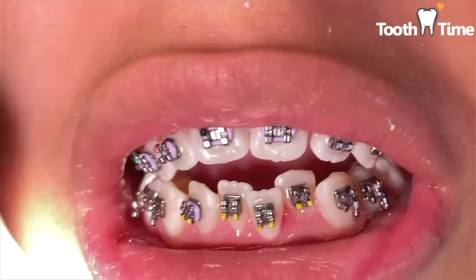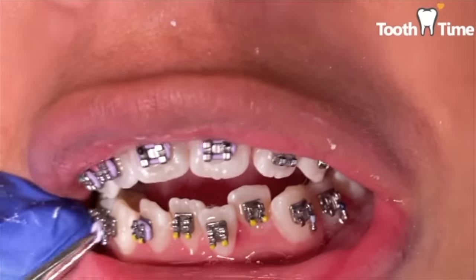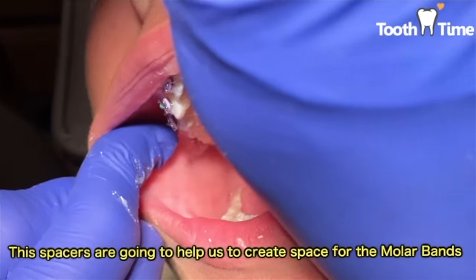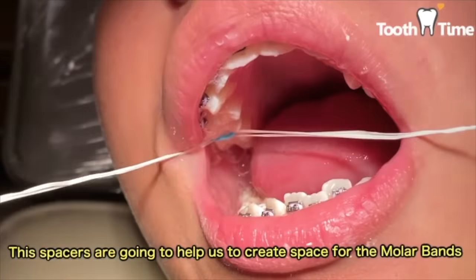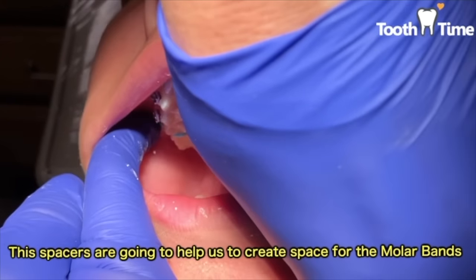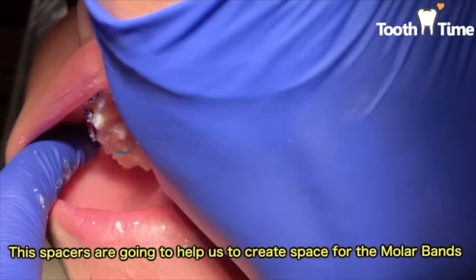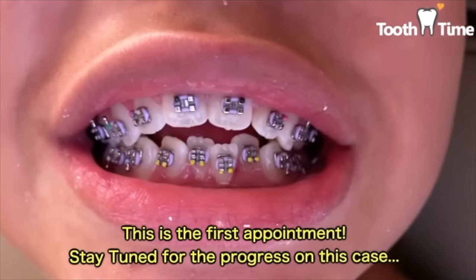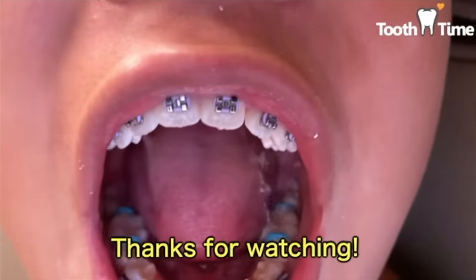Here's a quick video of the process of how we use a tongue crib appliance. So usually we'll place some spacers to create some space between the molars. We'll then bring them back, take some impressions to have those moldings done for the appliances. And then they'll come back and we'll finally deliver the appliance.